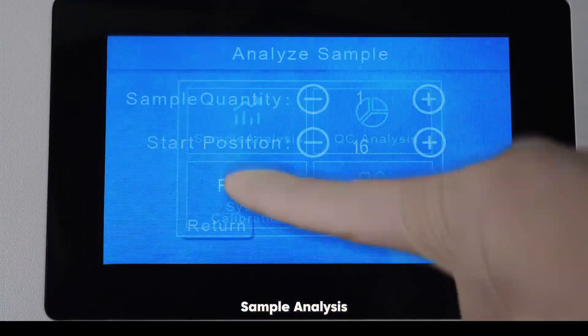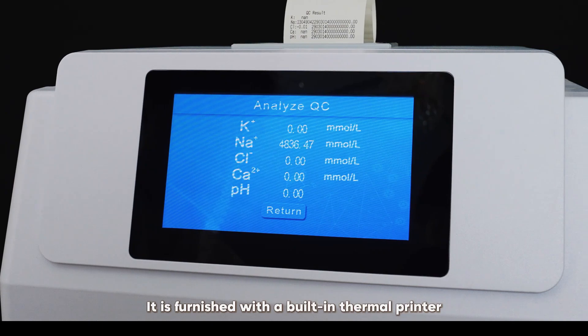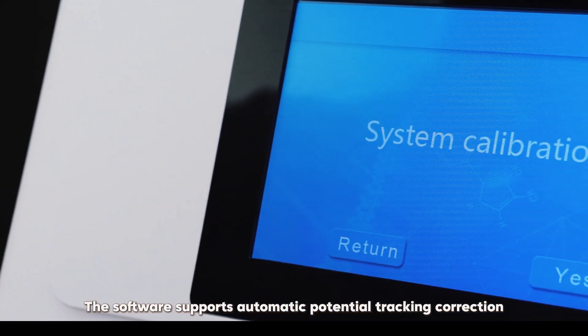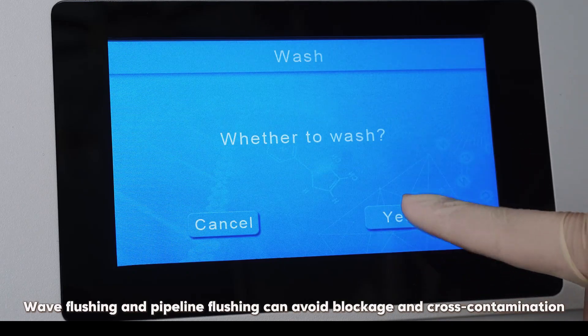Sample Analysis. It is furnished with a built-in thermal printer and is capable of printing results properly. The software supports automatic potential tracking correction. Wave flushing and pipeline flushing can avoid blockage and cross-contamination.